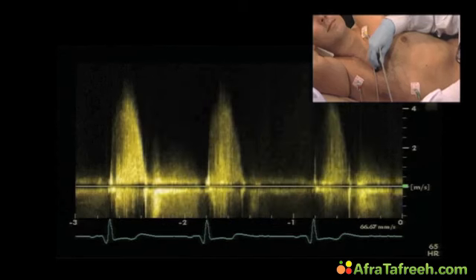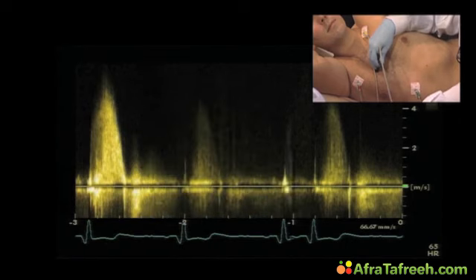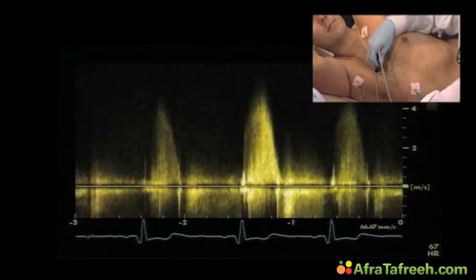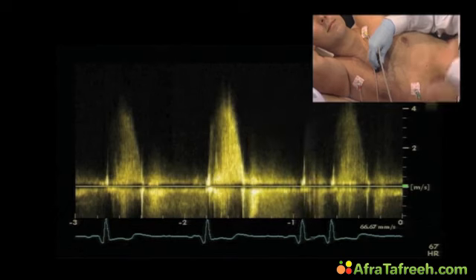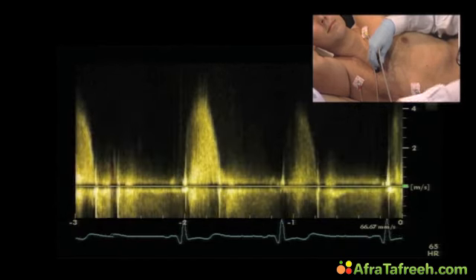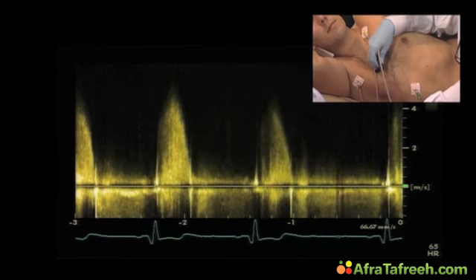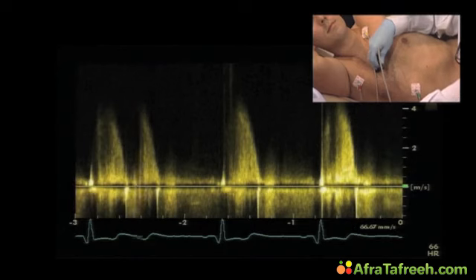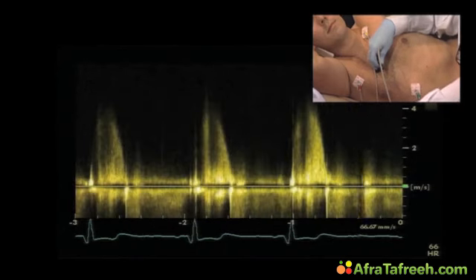This transducer position is ideal to quantify patients with aortic stenosis, and this is a patient with aortic stenosis, and we can see that the patient has a signal which moves towards the transducer. It's above the 0 line. So this must be the signal of aortic stenosis. You can also appreciate we do not have a 2D image, only the Doppler spectrum.